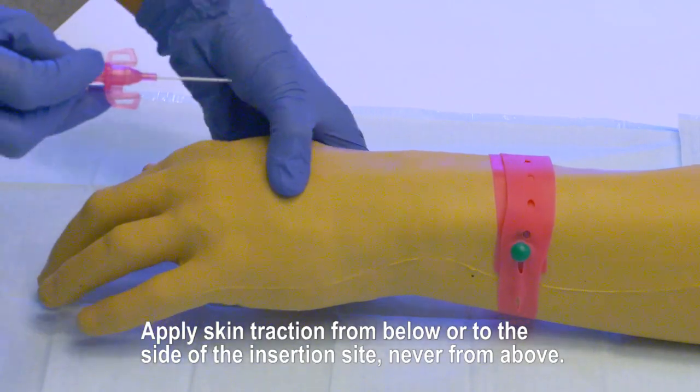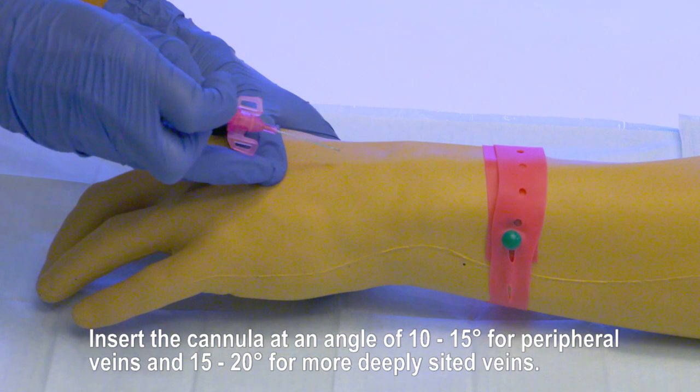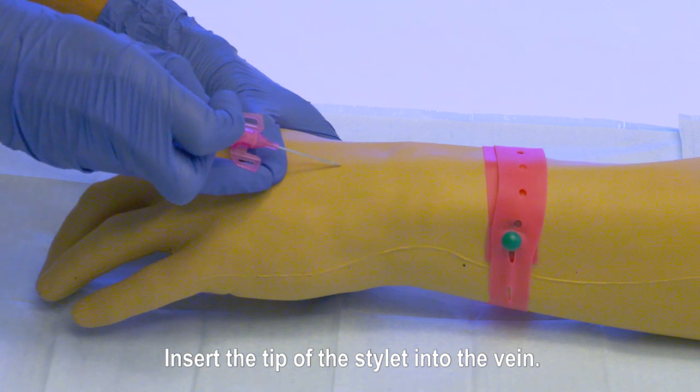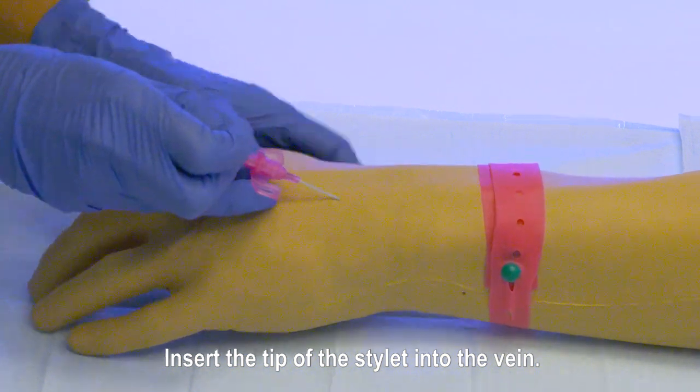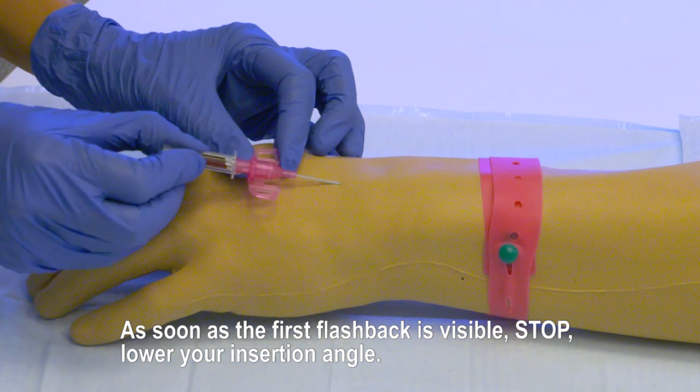Apply skin traction from below or to the side of the insertion site, never from above. Insert the cannula at an angle of 10 to 15 degrees for peripheral veins and 15 to 20 degrees for more deeply sited veins. Insert the tip of the stylet into the vein. As soon as the first flashback is visible, stop and lower your insertion angle.